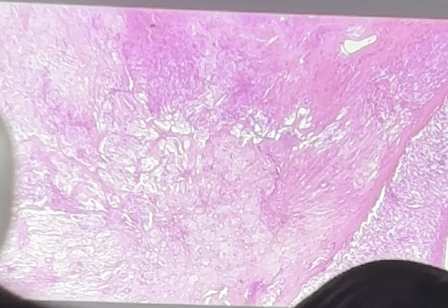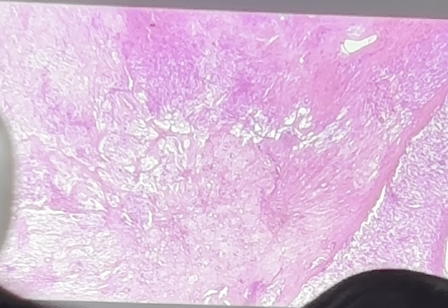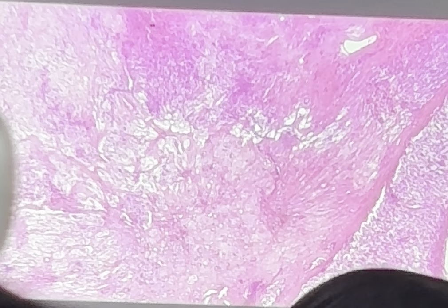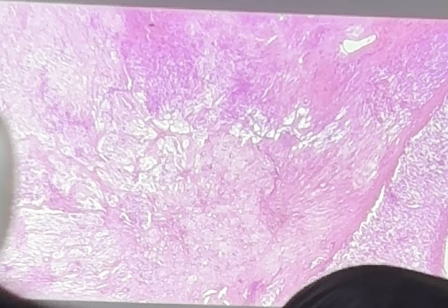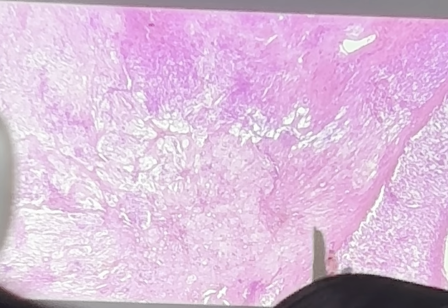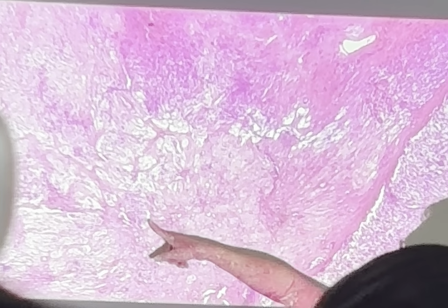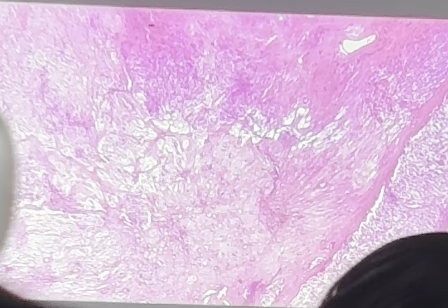So this one is unique because it's not just the epithelium, but it's also the stroma. So it's called a mixed tumor. This is a benign mixed tumor, also called a pleomorphic adenoma. What you see is a proliferation of both the mesenchyme, which sometimes looks like it's forming cartilage. It could form cartilage, it could form bone, it could be mucus-like, mucoid. And the epithelial elements are little solid nests of cells, forming sometimes glands, nests, solid structures.